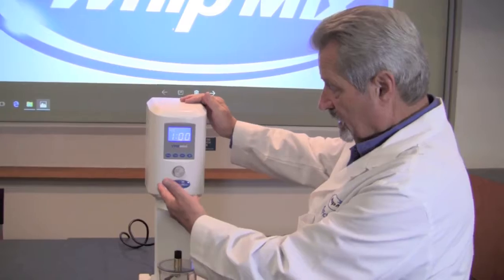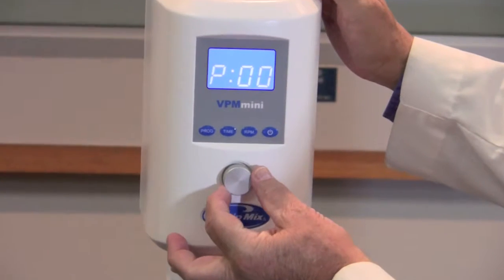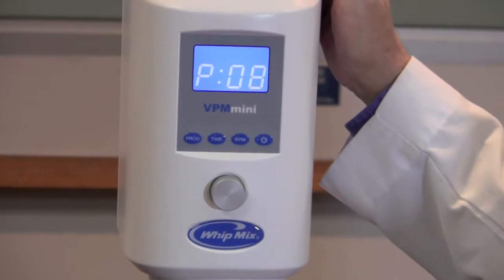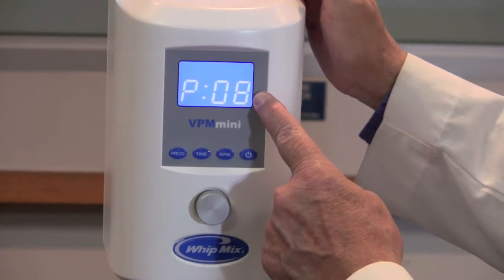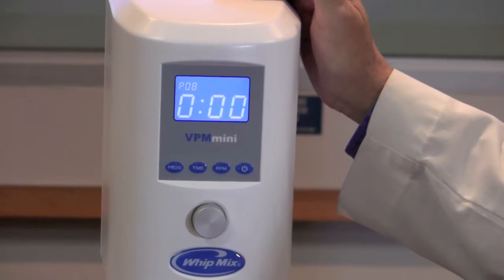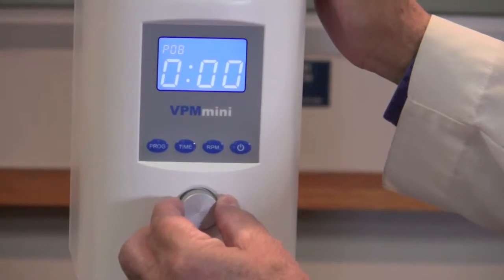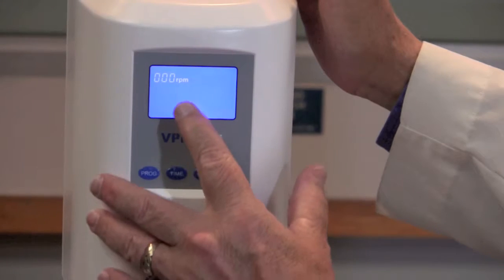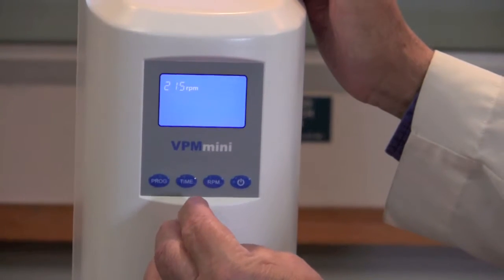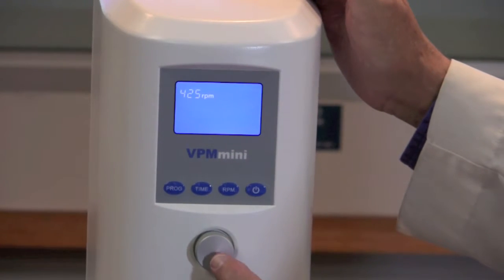Now we're going to program the machine. Go over to the left-hand side and select the program button, then use the silver knob in the middle and turn it either left or right to select a program that you would like to program information into. Once you've selected the program number, simply press the silver button. Now you've selected the program and it's going to ask you what RPM you would like. Go ahead and press the RPM button. You'll see the RPM notation in the top left — turn the silver knob until you reach the correct RPM for your particular product, then press the silver button.